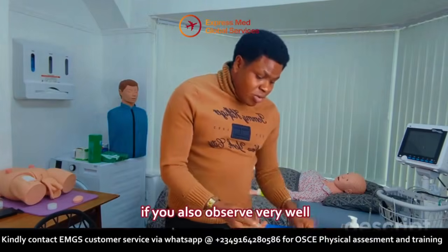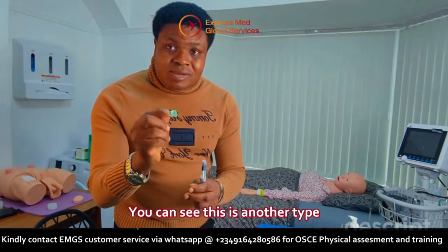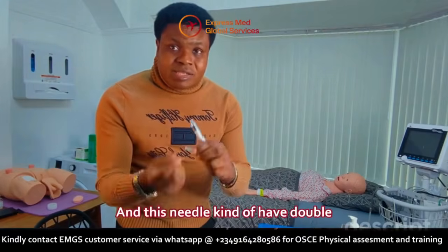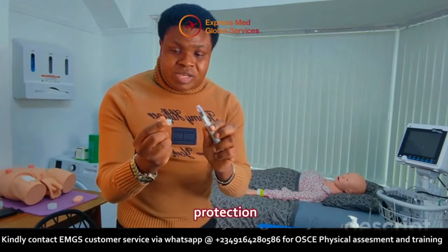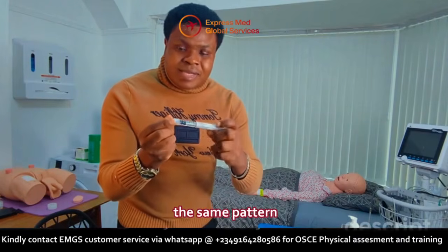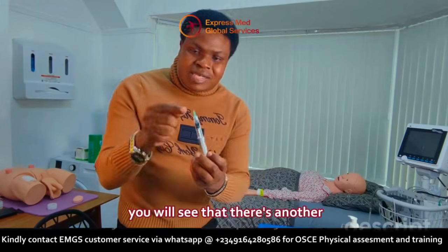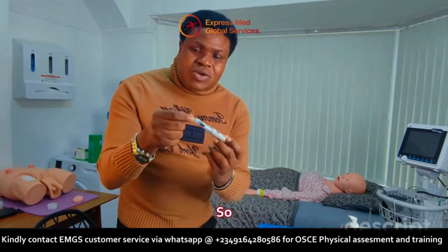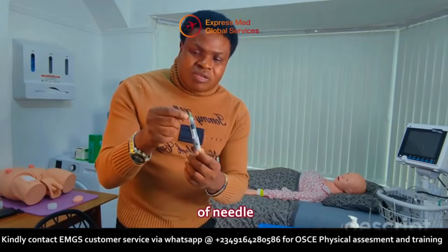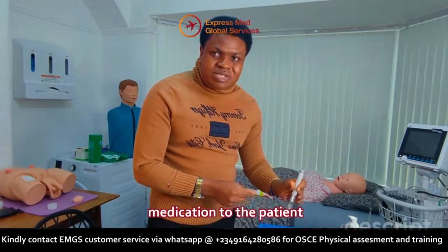Now, if you also observe very well, this is another type of needle. You can see this is another type of needle, and this needle has double protection. So if we activate this now, the same pattern, if you take this out, you will see that there's another covering. If you are not used to this type of needle, you may just go to the exam and start administering medication to the patient.